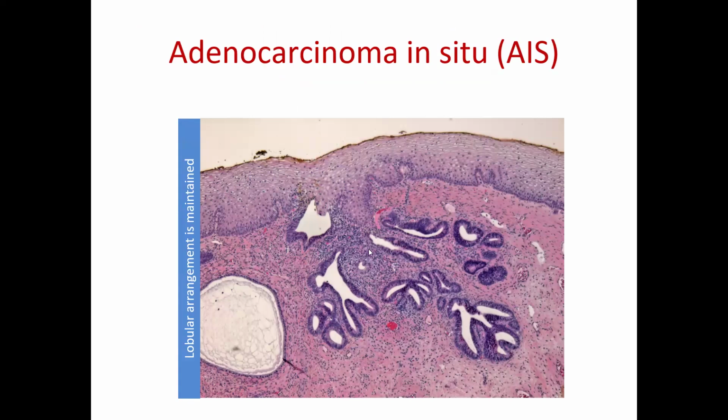All right, so what we have here is that these glands look abnormal. I hope you agree with me. They look more blue. It's not like here. Here you have some cytoplasmic mucin. These guys, they lost some of their cytoplasmic mucin. The nuclei are large, crowded, hence the slide looks blue. But the glands, even though they look abnormal, they maintain the lobular arrangement. I don't know if you can appreciate from this power some mitotic figures.